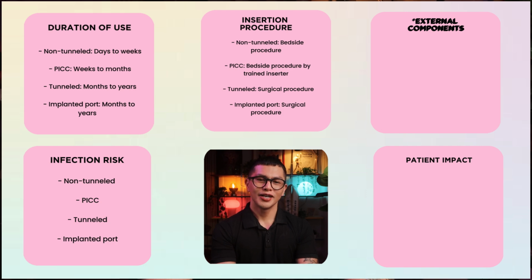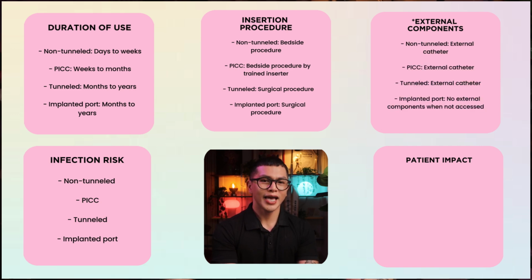Insertion procedure. Non-tunneled, bedside procedure. PICC, bedside procedure by trained inserter. Tunneled, surgical procedure. Implanted port, surgical procedure. External components. For non-tunneled, external catheter. For PICC, there's also external catheter. Tunneled, external catheter. Implanted port, no external components when not accessed.